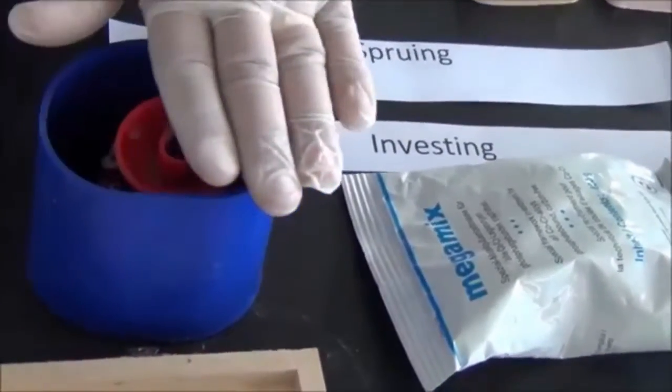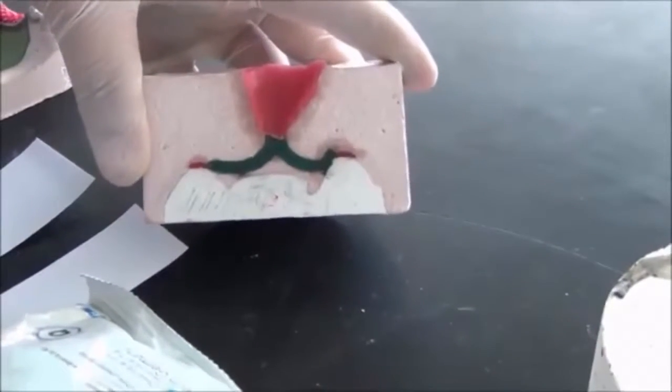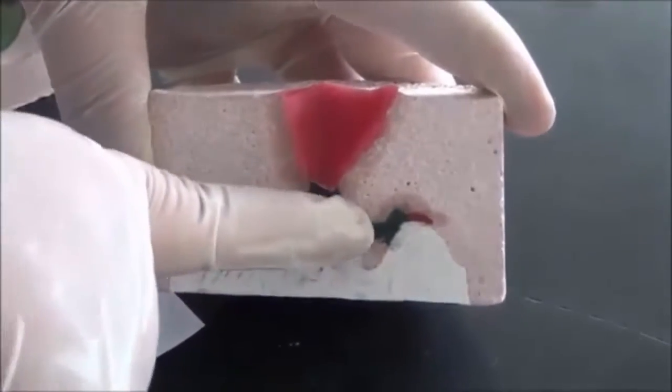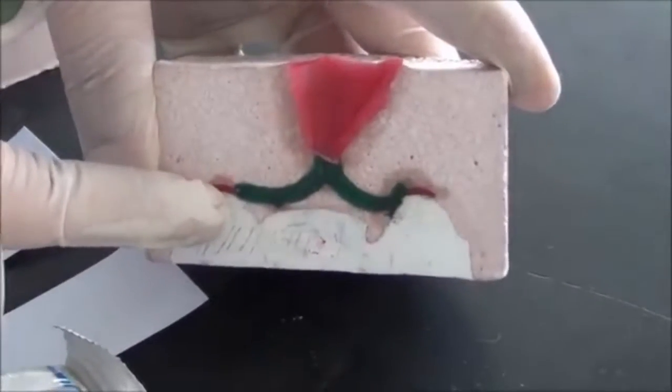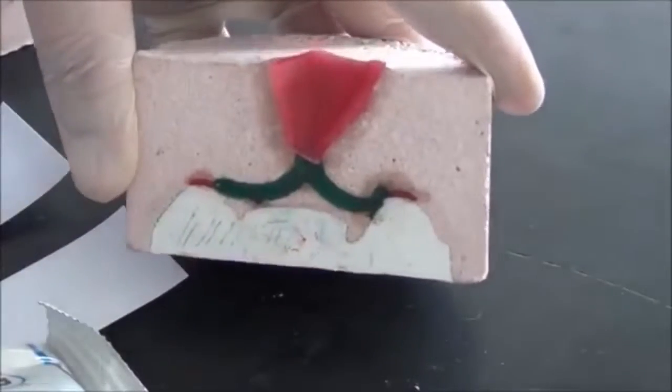If I take this out and after it sets, take a cross section of it, if I open it, these are the layers inside. You could see the funnel that we placed at the last step of the wax up, the sprues, and the metal framework there, and we could also see the refractory cast inside.